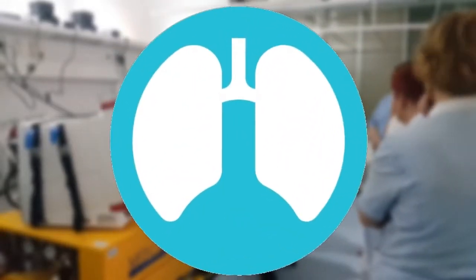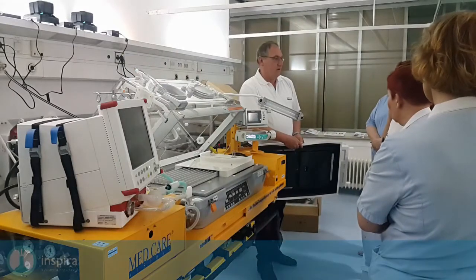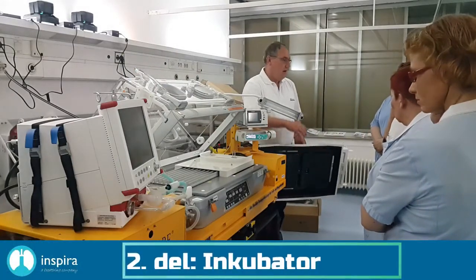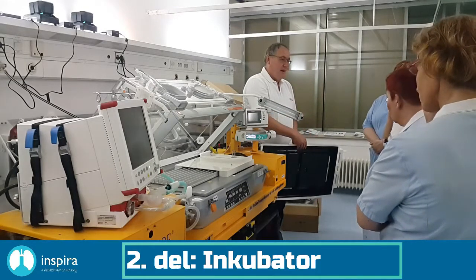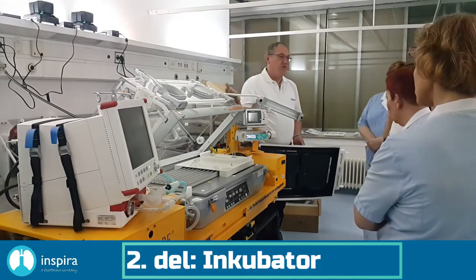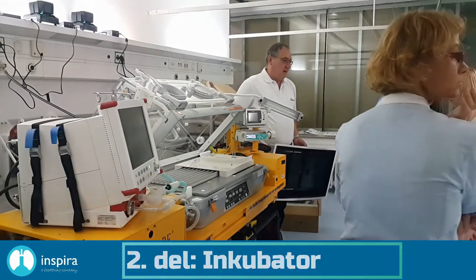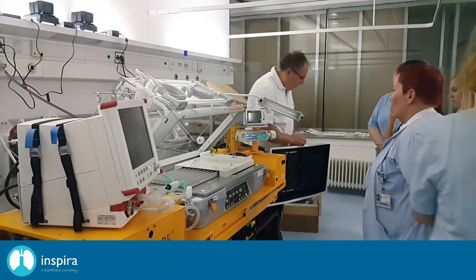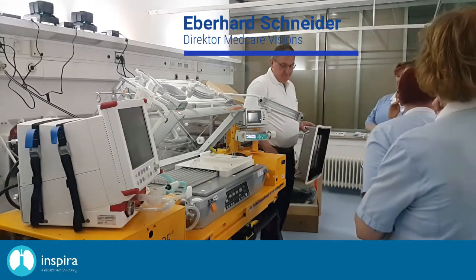Inside here, and then they put it in there. But the hood is not closing any longer, okay? But then they press the hood with force. And the result was that we have to change the hood because it was defective. We had to cut the hood because we couldn't get it off, okay? So the packing needs to be here on this rib, okay?